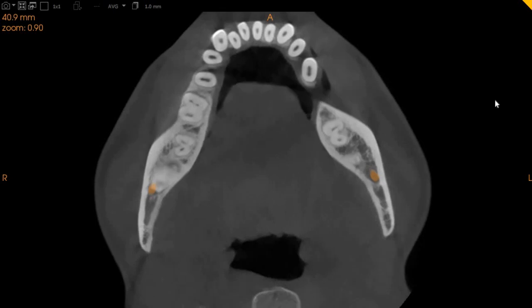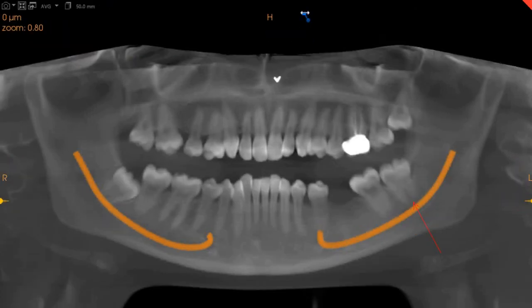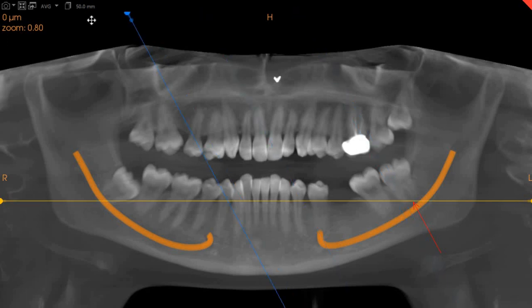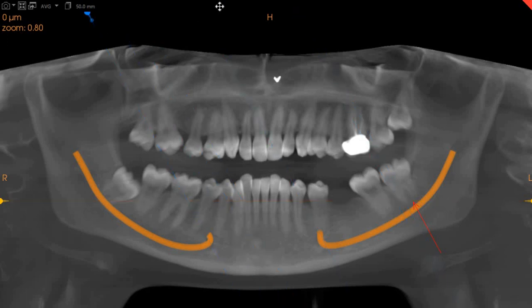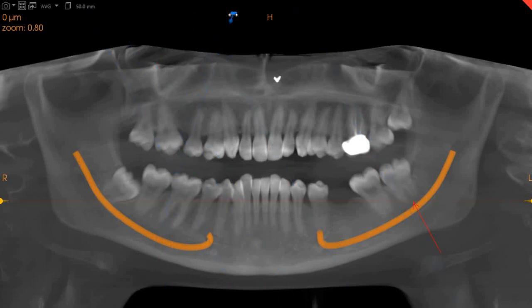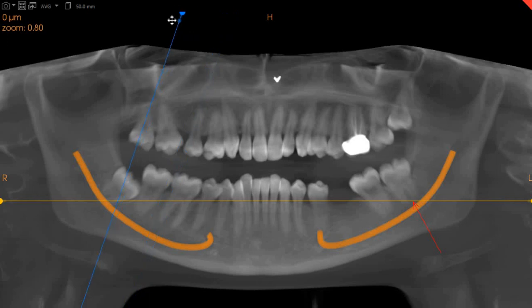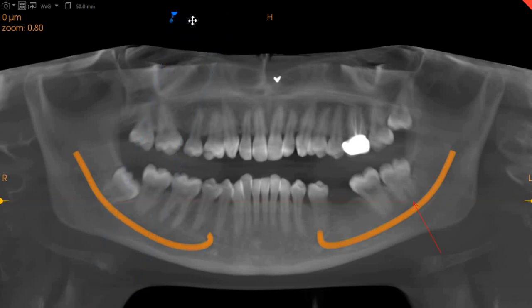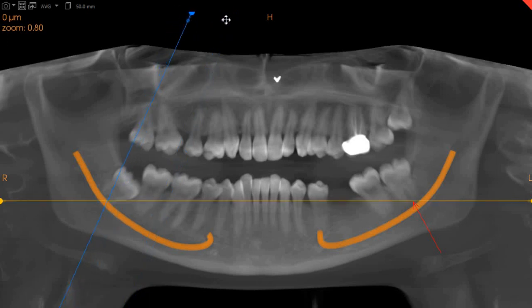However, moving to the lower right wisdom tooth — here you can see that the lower right wisdom tooth is extremely close. The roots are very closely associated with the nerve and are in very intimate contact right at the apex.